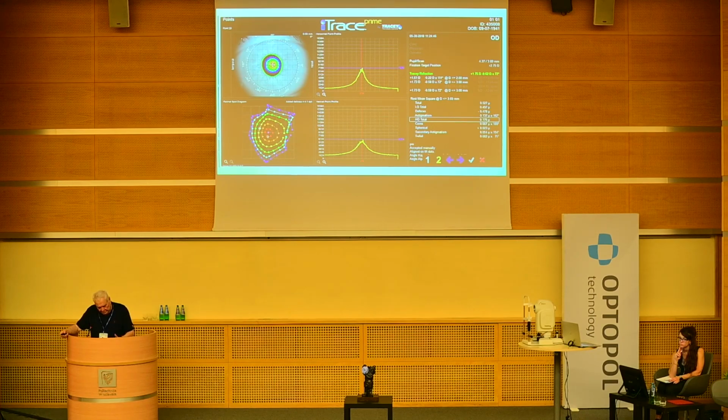In the middle, David asked me about XY, so that is X detector and Y detector. They give a cross-section of the point spread function. You get a point spread function in each point.